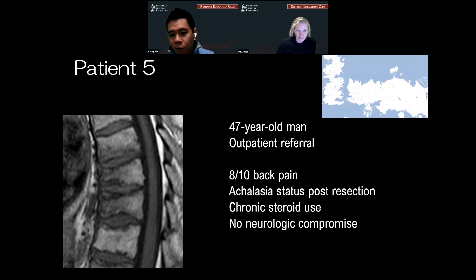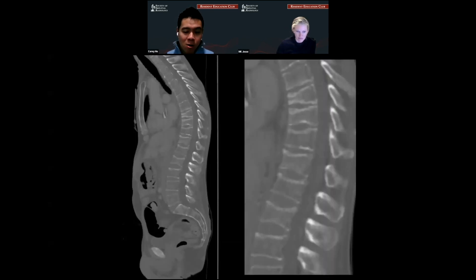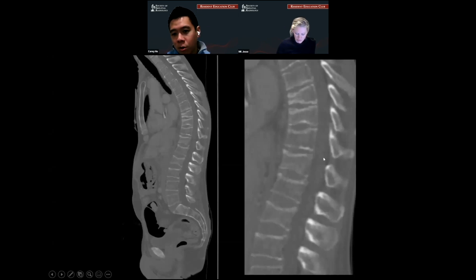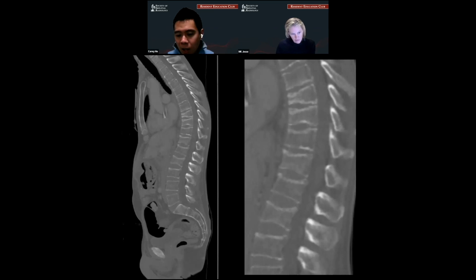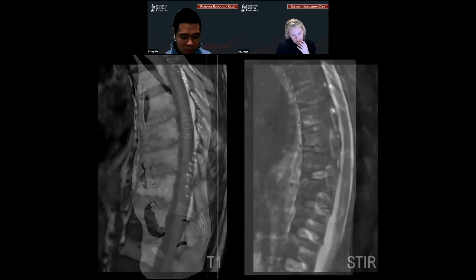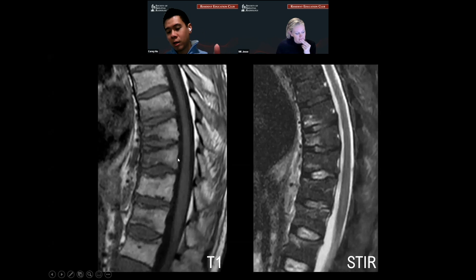Patient five is a 47-year-old man, outpatient referral, 8 out of 10 back pain, history of achalasia status post resection on chronic steroids, no neurologic compromise. We have multiple levels of vertebral body height loss. The important thing is we don't technically know how old these fractures are, but we know that the patient has bony demineralization from chronic steroid use. A lot of people get confused and think that the density is sclerosis of chronic healing, but this is actually compression of demineralized bone — that's why it looks like that. The accompanying MRI shows edema with abnormal T1 signal and STIR signal confirming these are recent fractures.